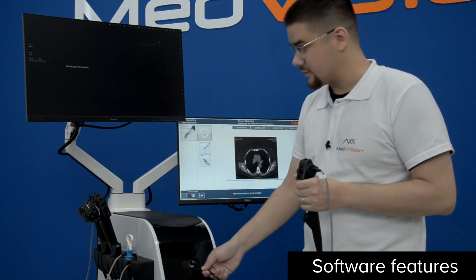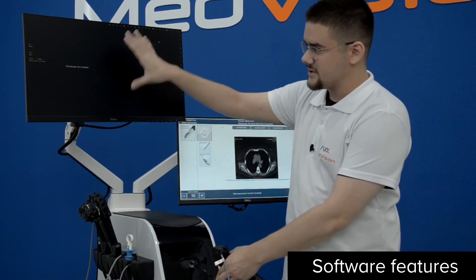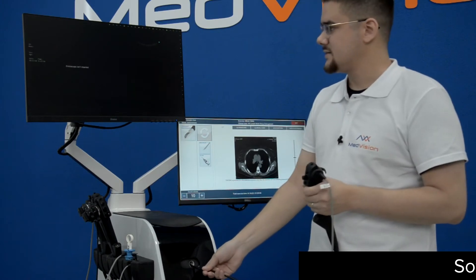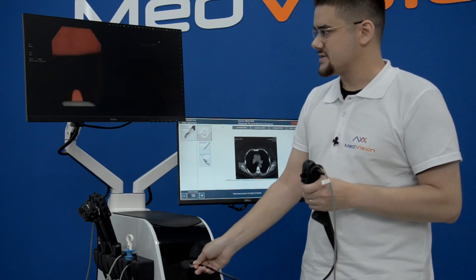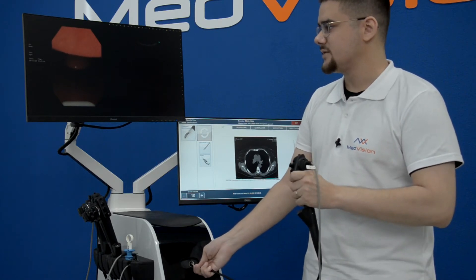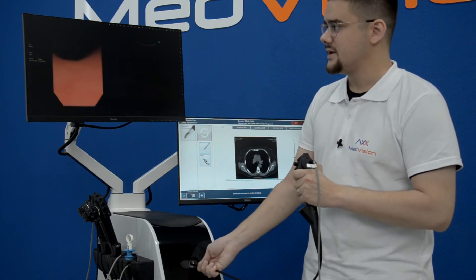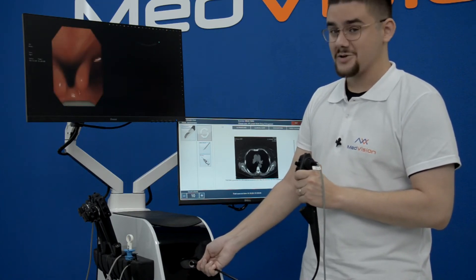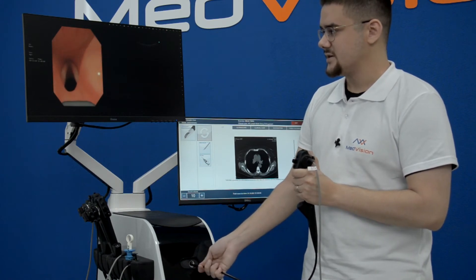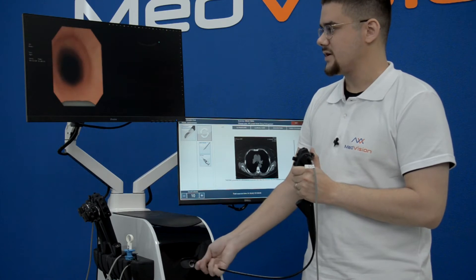We spoke before about introduction and removal of the instrument. This interface mimics the one of a real device. I will gently start working with the simulator. Handle rotation and all of the controls are exactly like they are with a real device, and we pride ourselves on the quality and fidelity of the graphics.